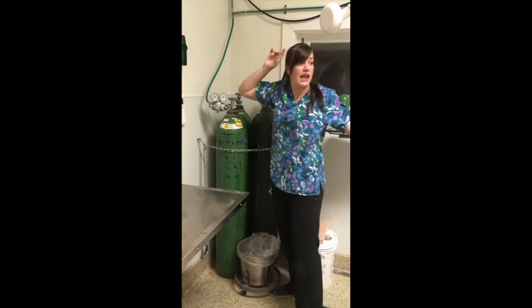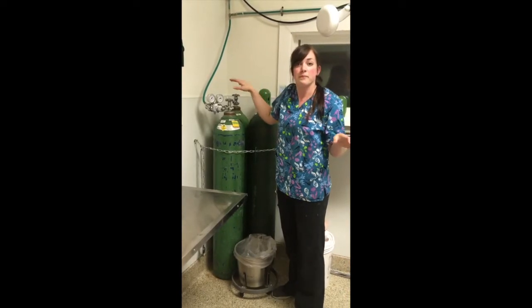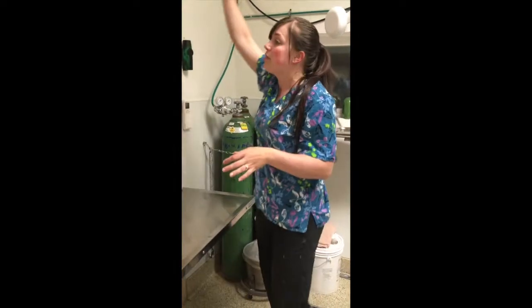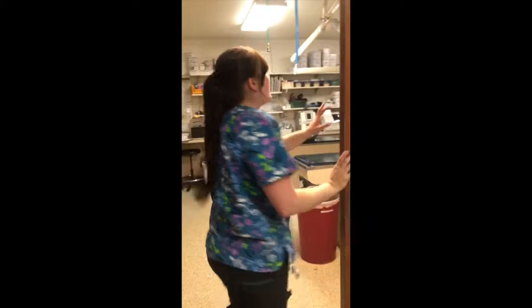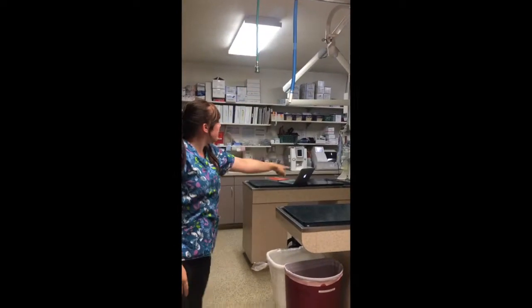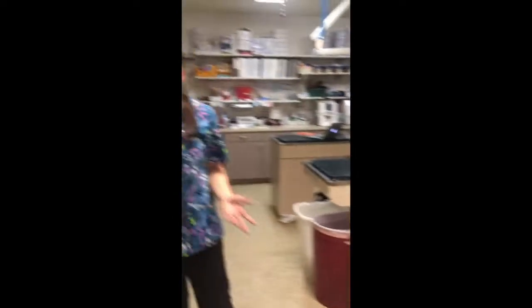So we do have ones connected here just in case our oxygen generators fail. And then they come all the way up and through, and then follow the lines all the way to our treatment and down to our portable unit, down to our treatment unit, and that is where oxygen comes from.